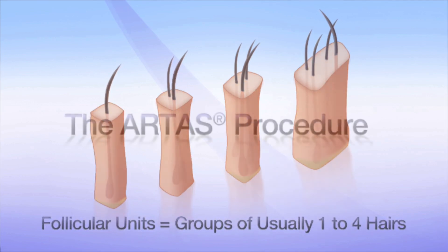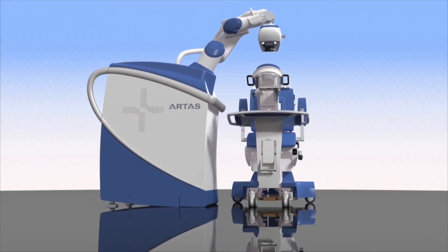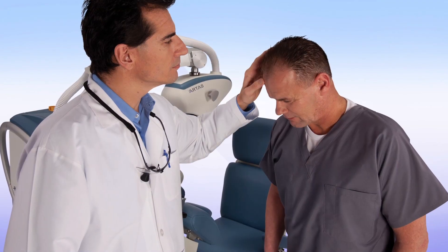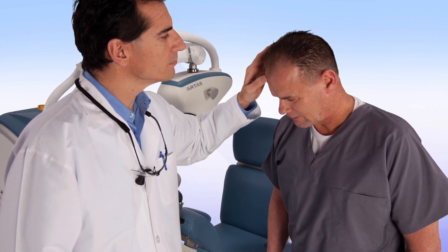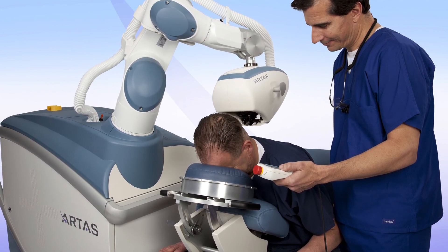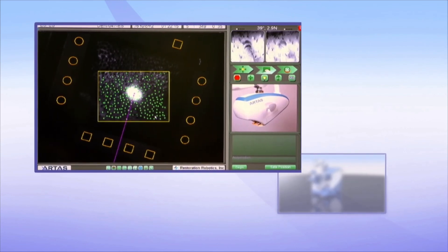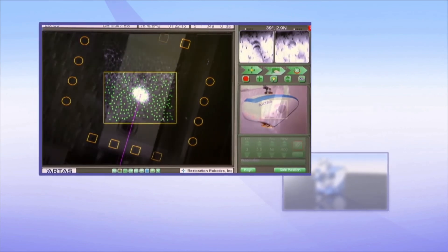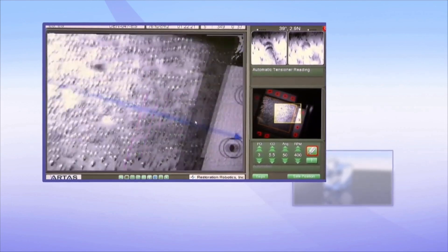Here is a step-by-step look at this safe and effective process. Prior to the procedure, you and your doctor will discuss and determine the best treatment plan. You'll then be seated comfortably in the ARTAS chair, where your hair will be trimmed so the system can digitize each follicular unit. Your doctor will then position the robotic arm to start the procedure, and the ARTAS system will methodically identify each follicular unit at its optimal approach.